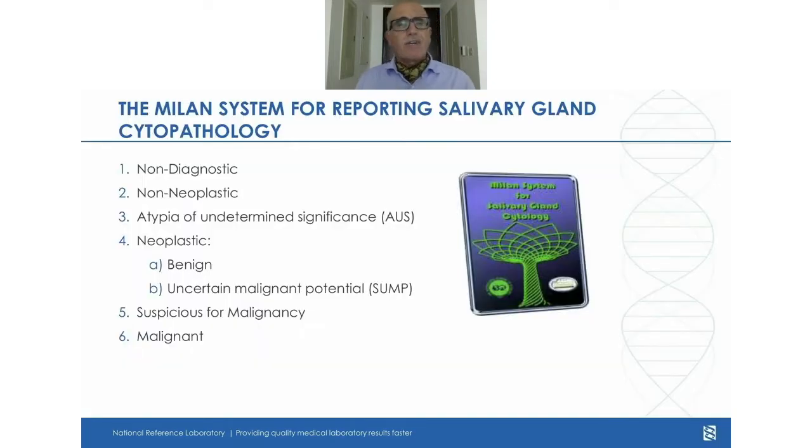So which is the classification most commonly used? I have to say, because of my age, this is not the first classification I've been using. I hope it won't be the last one, it might though. But anyway, every classification needs to be explained and has its gray areas, and there's nothing replacing a good description of what you see on the slides, together with a final diagnosis suggesting possibly the differential.